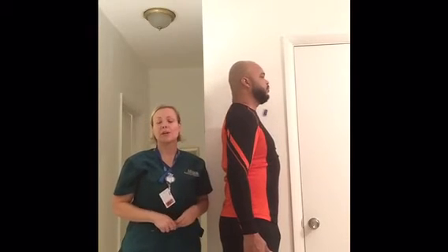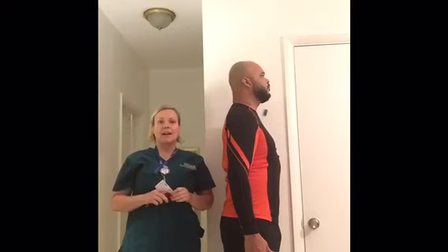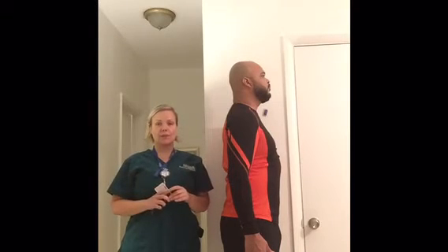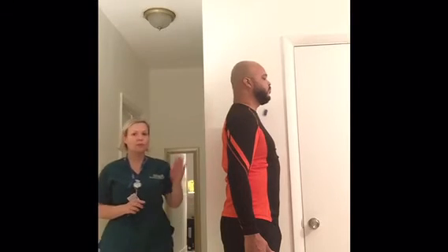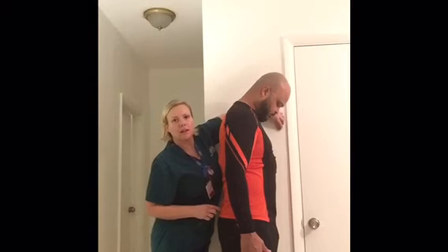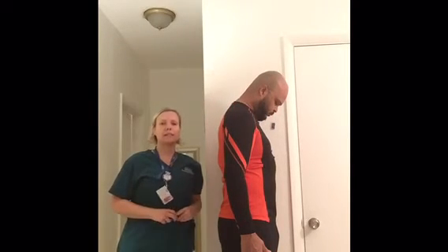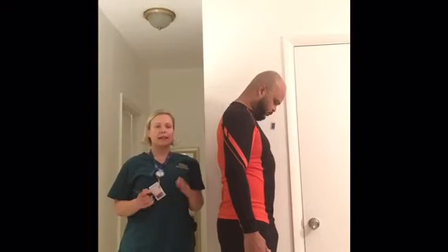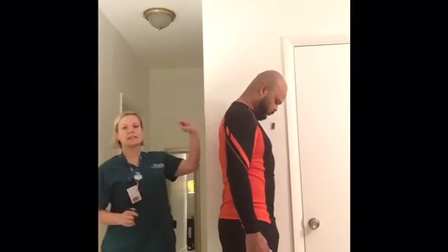Thank you. Then we're going to do a flexion, and we want you to look down. Please look to the floor. Okay, thank you. With this one, we want to see the spinous processes separated from each other, and you can relax your head. Thank you.